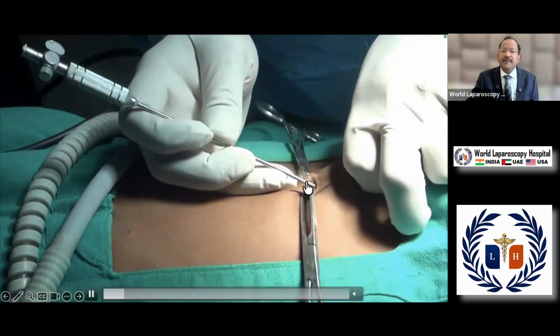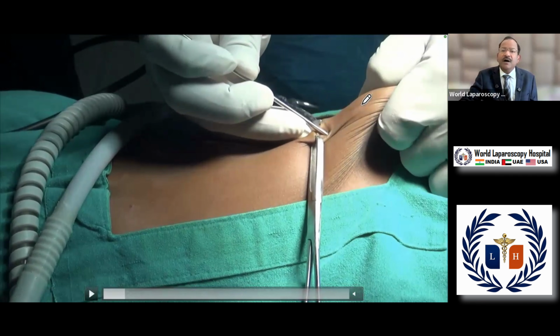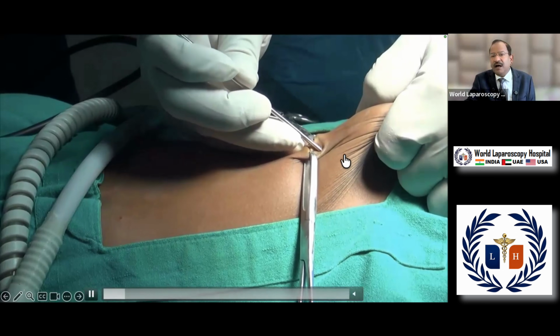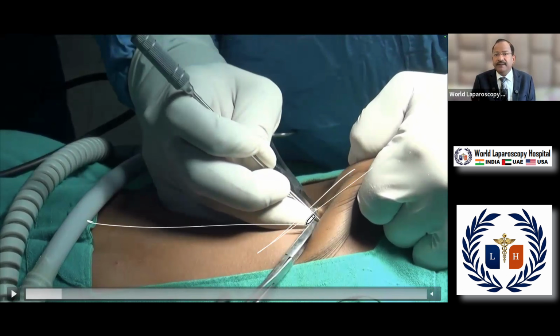So look at this, what is happening. Once you lift it, here is the abdominal wall. So what is this angle? 90 degrees. And what is this angle? 45 degrees. And where is it pointing? Towards the anus. But in relation to the abdominal wall, is it oblique? In relation to the abdominal wall, it is perpendicular, but with the body of the patient it is oblique.